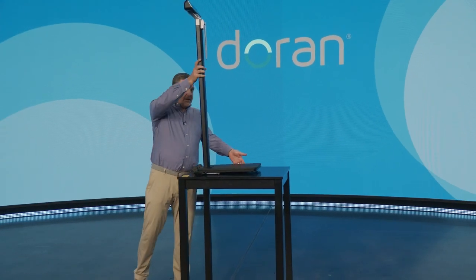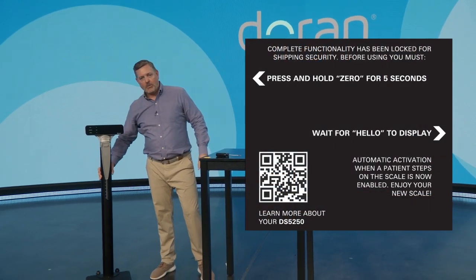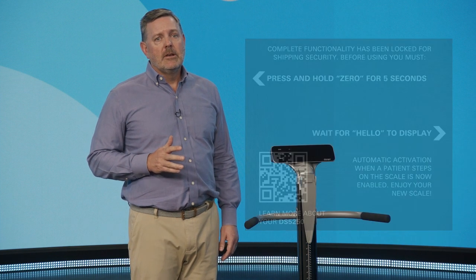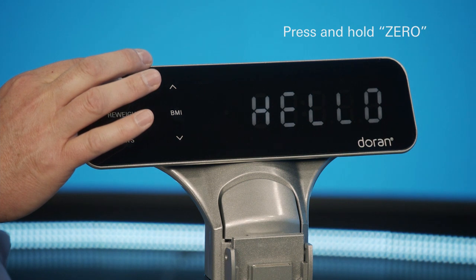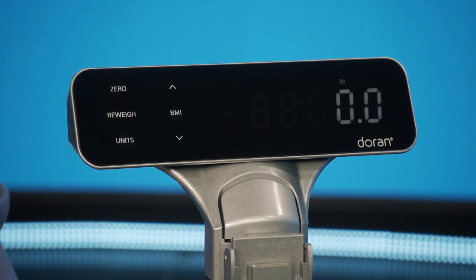Remove the protective indicator film and follow the instructions on the remaining label before removing it. Only perform this process after the scale is fully assembled. To activate the scale, you must press and hold 0. You will hear several beeps and the scale display will read hello when the process is completed. Then release the 0 button.